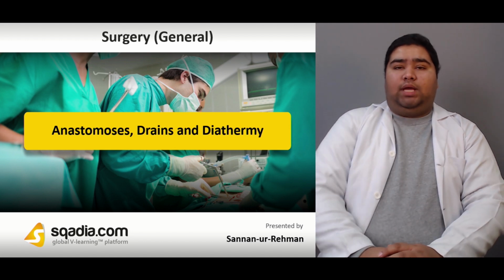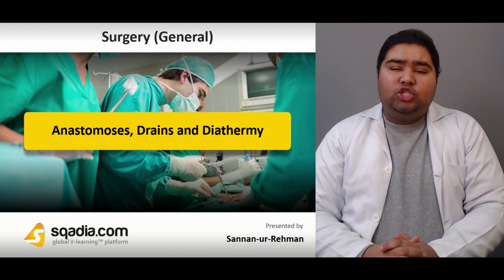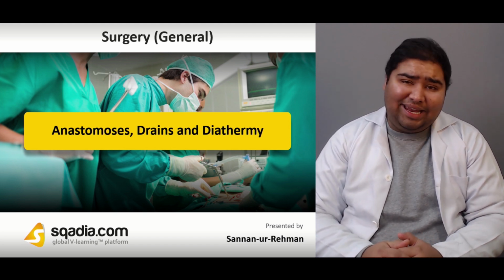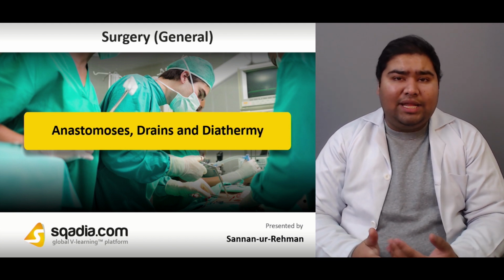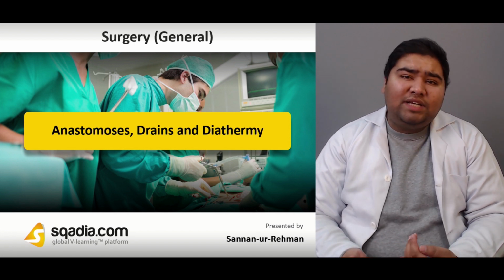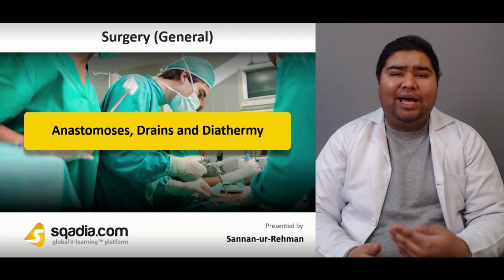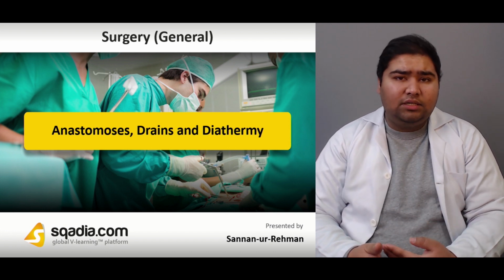Now, diathermy. Diathermy is actually a probe that is used for charring and cutting. Whenever you go into the operating room, you might have already seen they use a pen-like probe or an instrument that is used to cut the tissues. The principle of diathermy is that electric current passes through the tissues and causes charring of the tissues. So diathermy is a probe that is used to cut and divide the tissues.